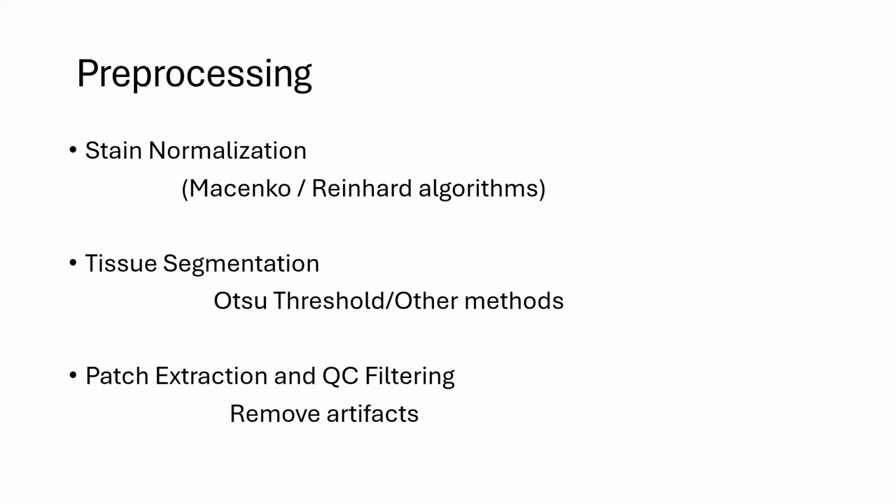and we can find the mask from the image. What is the need? Because if you are taking a WSI image, it has a lot of white space, because the tissue part is very small and the big outer part is background. So we have to find the mask in which the relevant tissue parts are. Otherwise, you are wasting computation time processing the background. So that's more important, and that's called tissue segmentation.